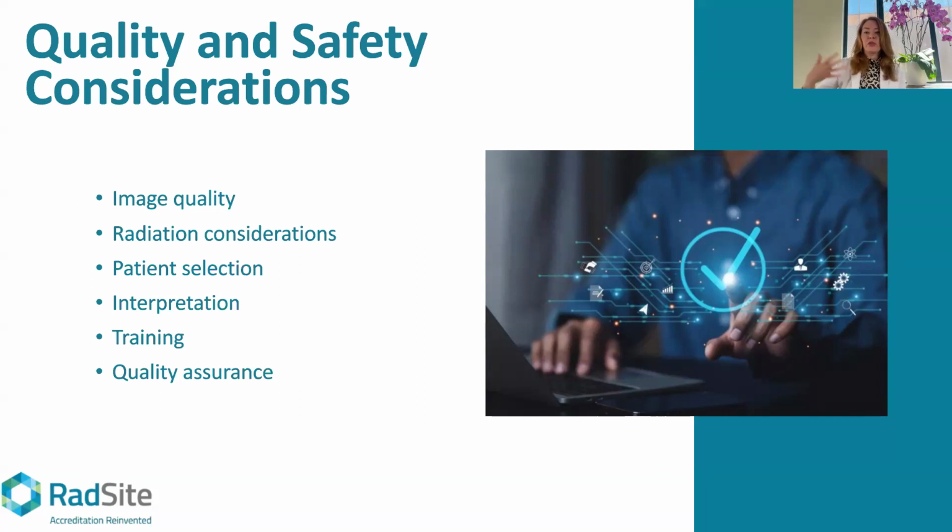And then on top of that, once we got the diagnosis, unfortunately, of brand new DCIS on the opposite side, we had not performed the contrast up front, which I usually do, but for the sake of time, we didn't do that for this one patient. So now we have the cancer diagnosis. We did the study again with the contrast. Ideally, we wouldn't do that. Ideally, we do the contrast up front.